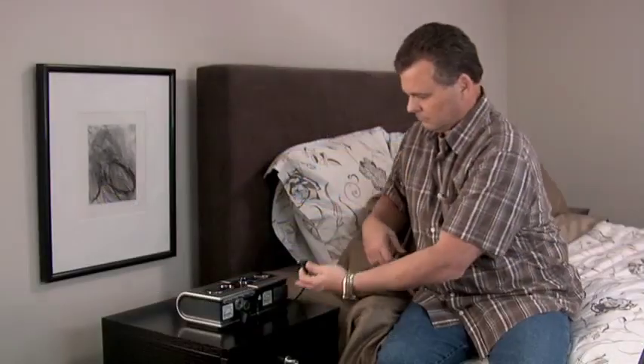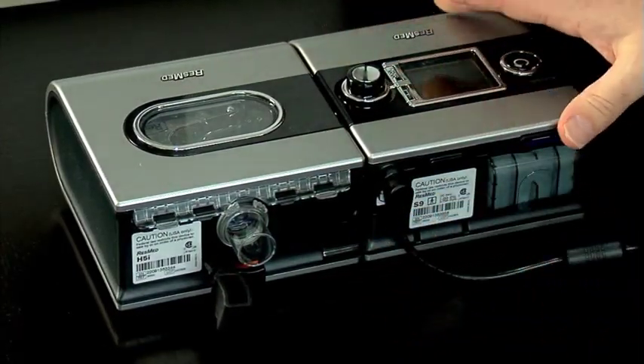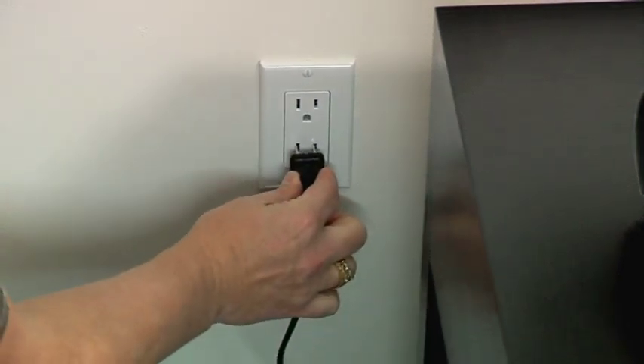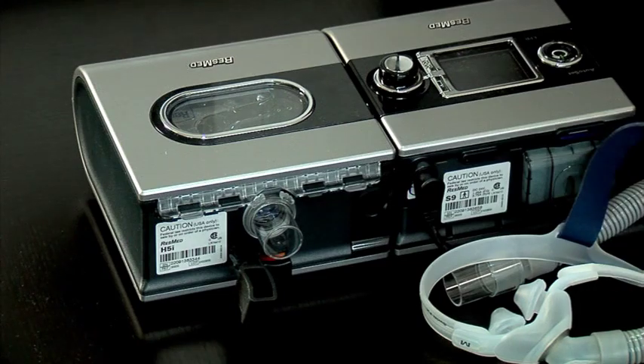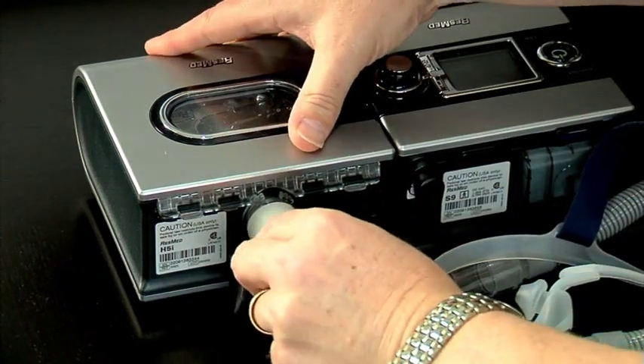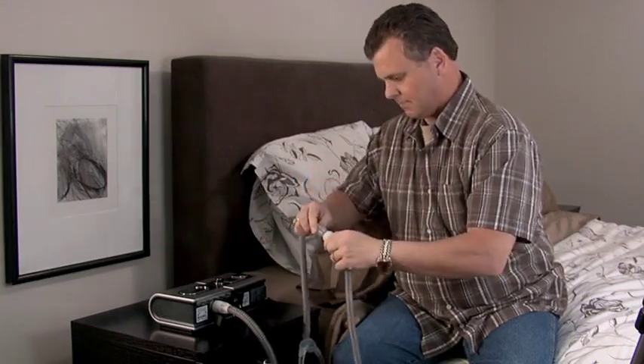The first thing you'll do to set up your system is to connect the DC plug of the power supply unit to the rear of the flow generator. Connect the power cord into the power outlet. You'll then connect one end of the air tubing firmly onto the air outlet and connect the assembled mask system to the free end of the air tubing.